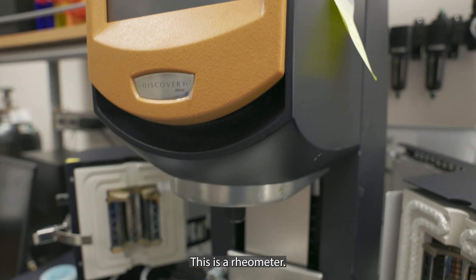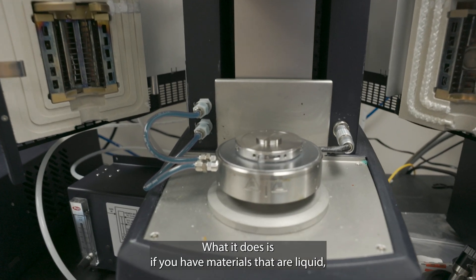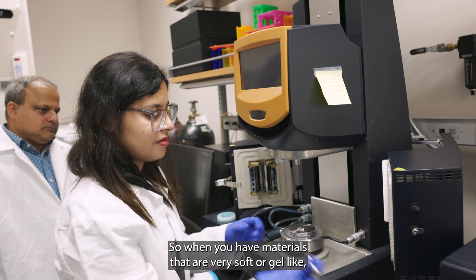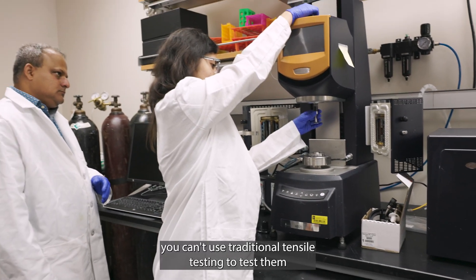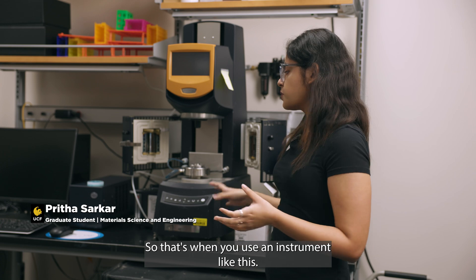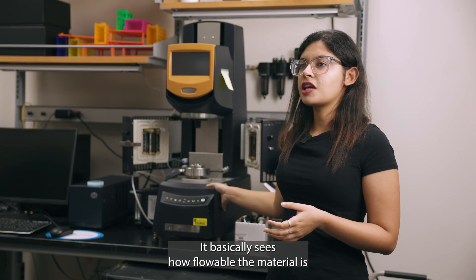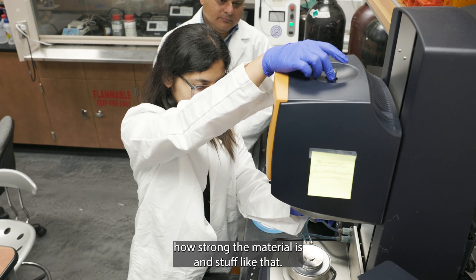This is a rheometer. What it does is — if you have materials that are liquid or viscoelastic, it can measure their mechanical properties. When you have materials that are very soft or gel-like, you can't use traditional tensile testing because they'll fall apart. That's when you use an instrument like this. It basically measures how flowable the material is, how strong the material is, and so on.